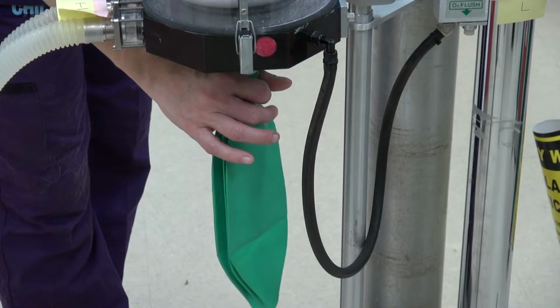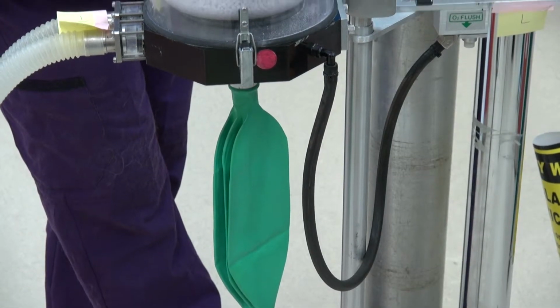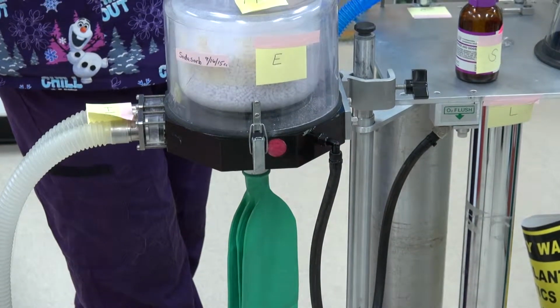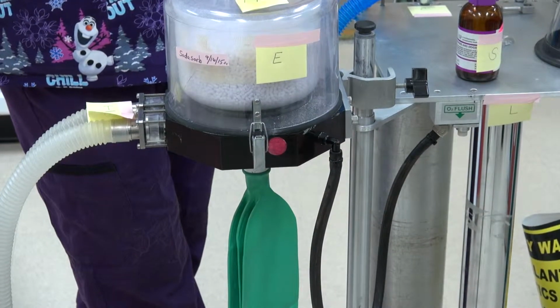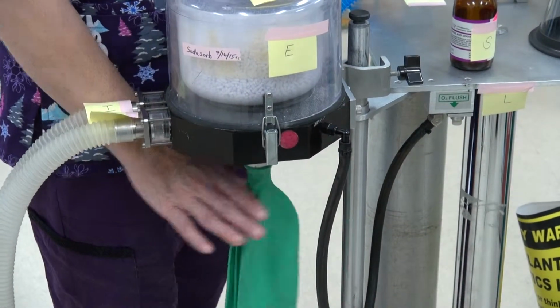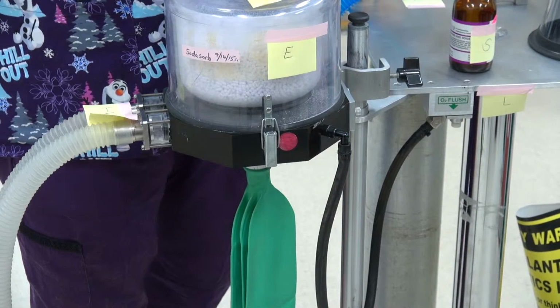When we determine the bag size, what's another consideration that we should make? Going one size up. Yes, always have one size larger bag when you're determining your bag. So if I am picking a 2-liter bag, I always want to have a 3-liter bag ready also, correct? Correct. Okay.